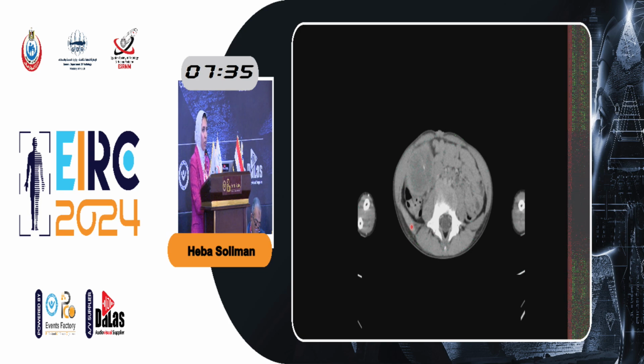So the decision in the MDT was upfront surgery, and this was a case of mesenchymal hamartoma, as was suggested. But unfortunately, an embryonal sarcoma arising on top of it was found in the pathology specimen.